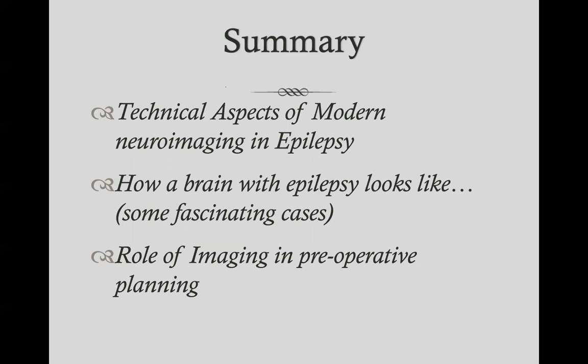So I will speak about some technical aspects of modern neuroimaging in epilepsy. I will show you what a brain with epilepsy looks like. So I will show you some cases, and I will say something about the role of imaging in preoperative planning.